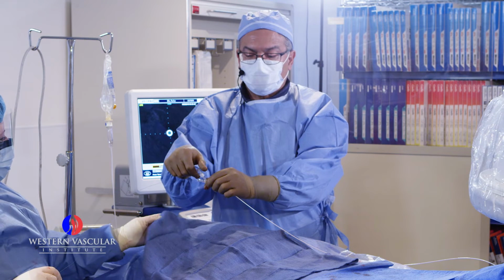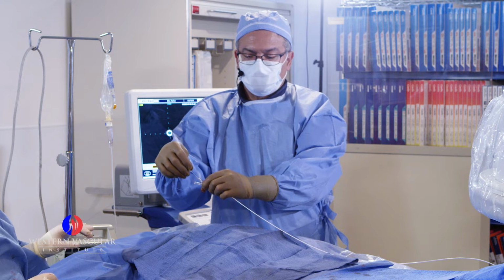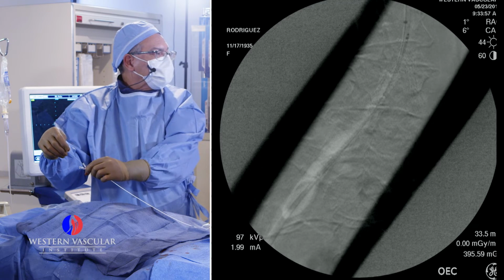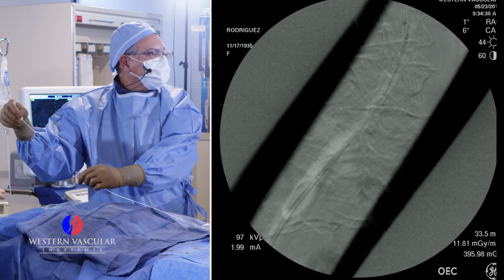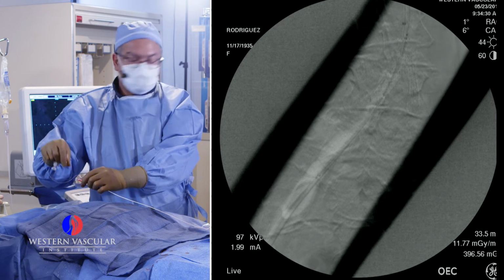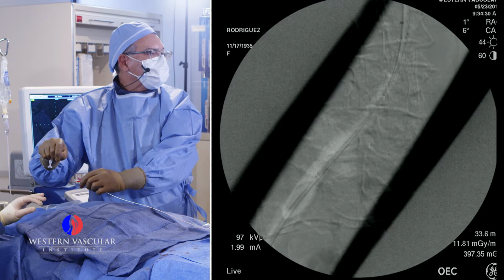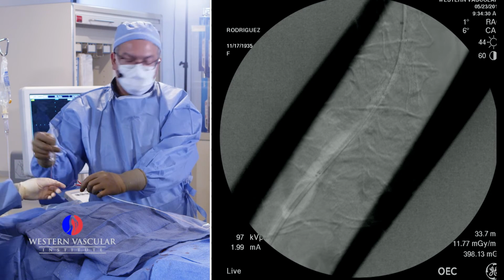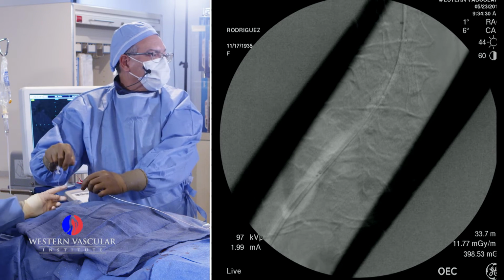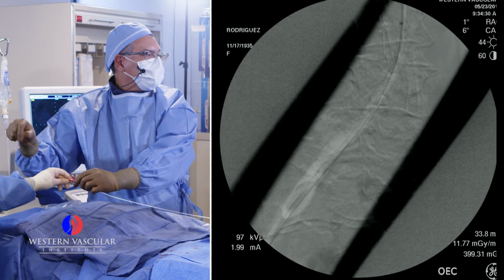This is the end of the catheter. It has this knob. I'm going to do a counterclockwise rotation, and then I start pulling this string, and you will see how the stent is going to start deploying on the screen. You have actually to pull a significant amount of it. You can see opening on the top, and it just comes down, opening little by little until we reach the other end. Here we go.